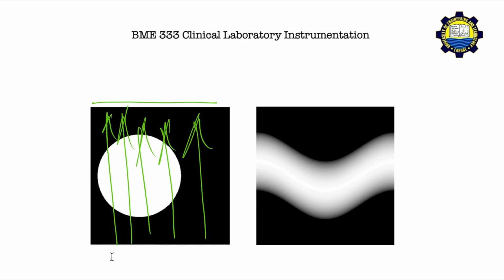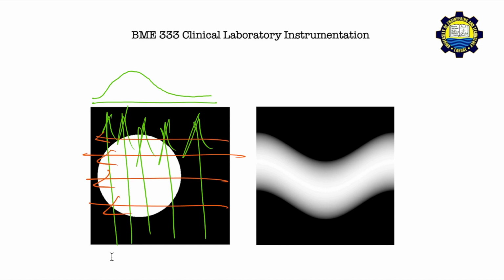You should be able to tell that a projection would look like this, slightly centered on this hand side, but when you look at it from a 90-degree perspective, these projections would probably be centered.